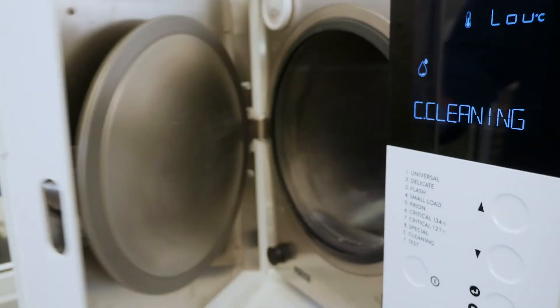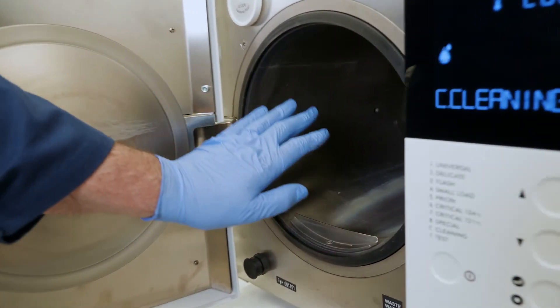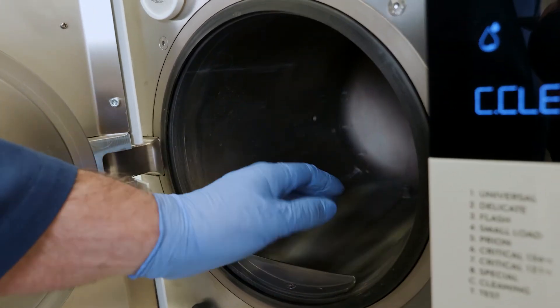At the end of the cycle, open the door and wipe the chamber with a clean cloth — a paper towel damped with demineralised water.